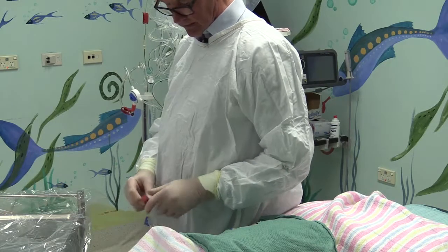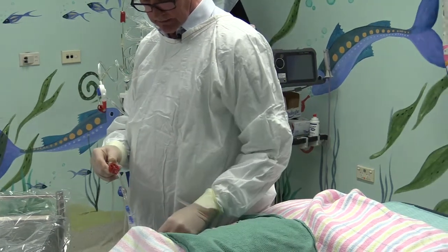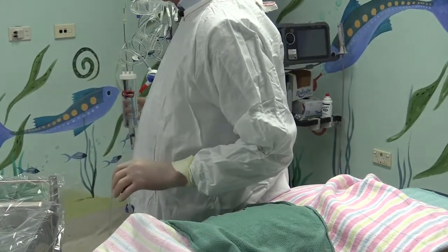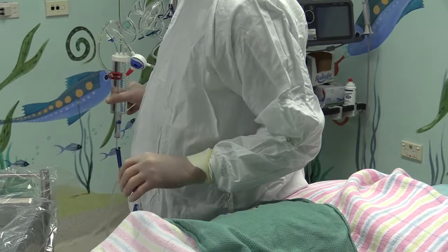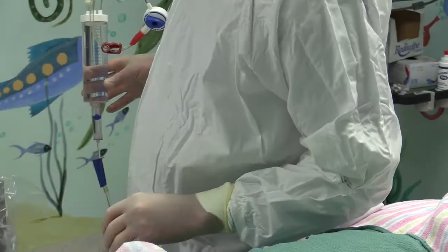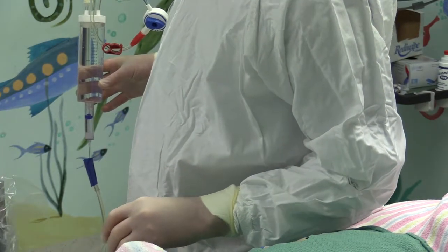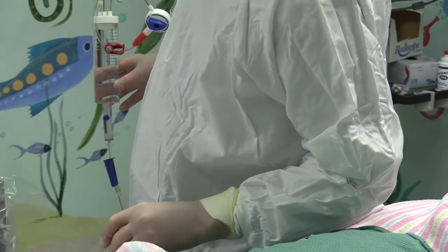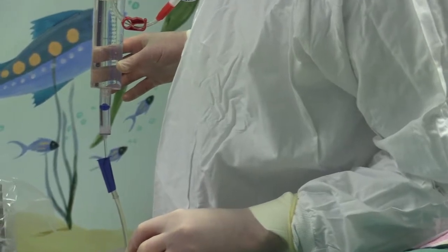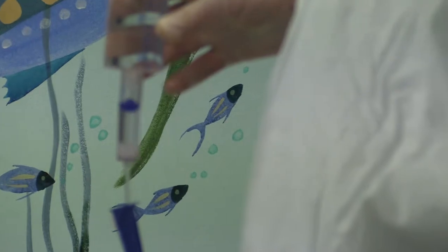We can open the red clamp on the patient line, and we watch carefully on the burette to make sure that we only administer the agreed dose to the patient. You can see that the rate of flow will depend upon the height of the burette, so heightening the IV pole or lowering it will change the flow of the fluid into the patient.